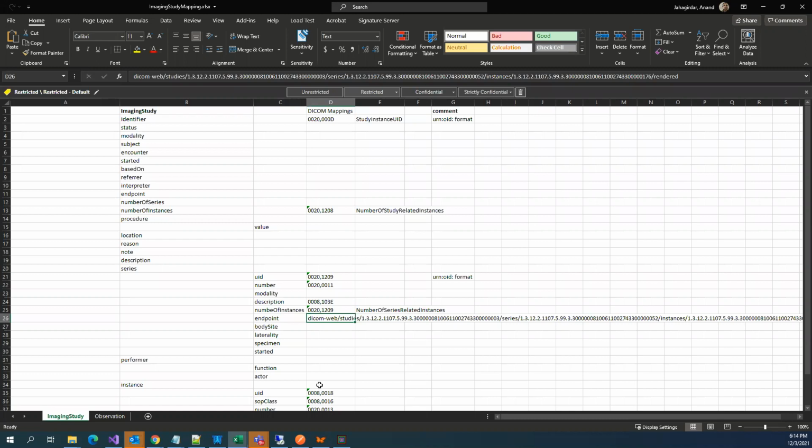So in the Connectathon, how are you planning out the 1.5 or 2 days?